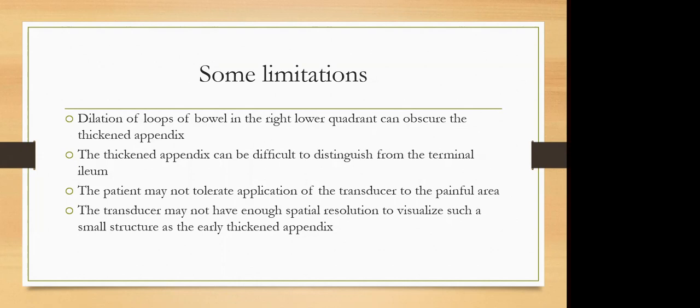So that also places some limitations in terms of what kind of equipment we are using to diagnose appendicitis using ultrasound. And another thing is that the patient reports, I feel pain here, but when you put the probe on, they say, no, you're hurting me more. So that also is a limitation of ultrasound.